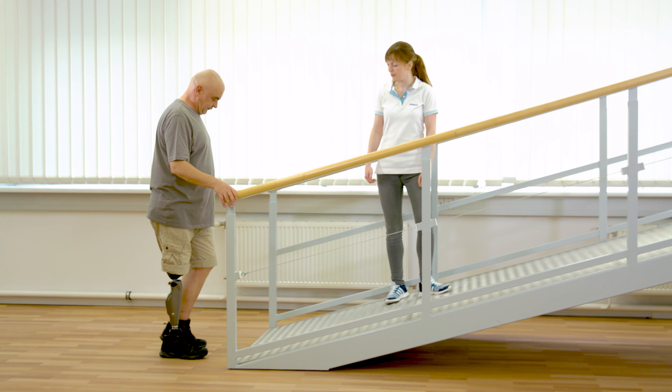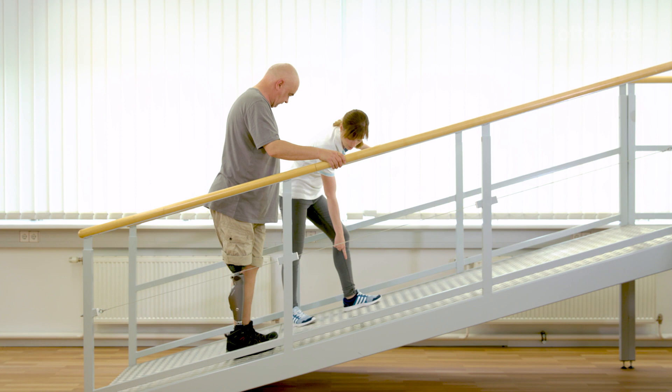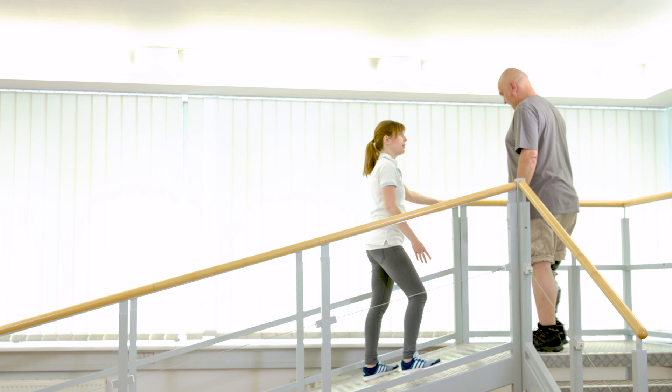When walking uphill, circumduction and hip hiking are common mistakes. Stance release will not be triggered due to early unloading of the prosthesis. Gerhard should instead roll over the whole foot, then imagine kicking a ball to activate the hip flexors. On steep slopes like this one, it is harder to move forward and to generate enough toe clearance during swing phase.